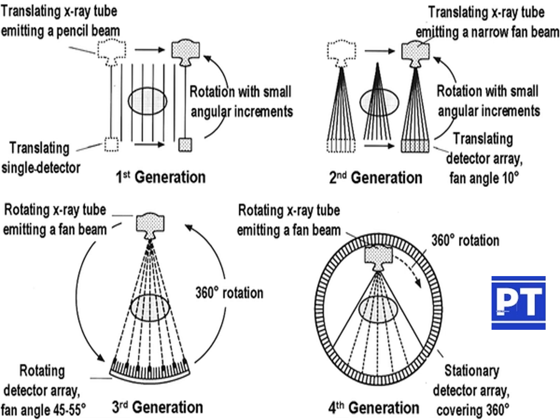Once a linear movement has gone, about 160 steps are required to cover one linear movement. After 160 steps of linear movement, the X-ray tube will rotate by 1 degree. Likewise, it will rotate approximately up to 180 degrees. So the scan time is longer, about 25 to 30 minutes in the case of first generation.